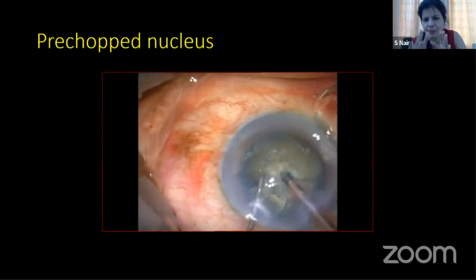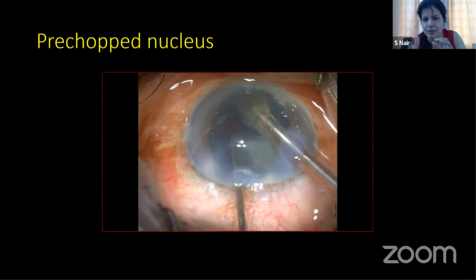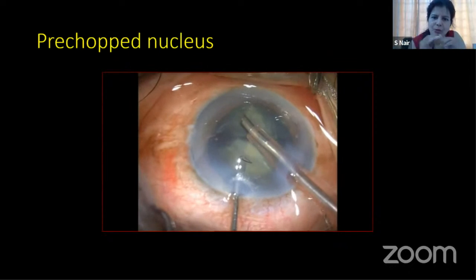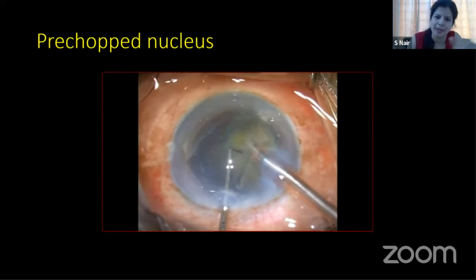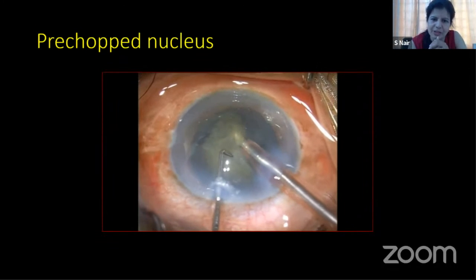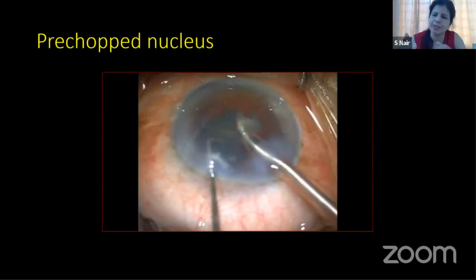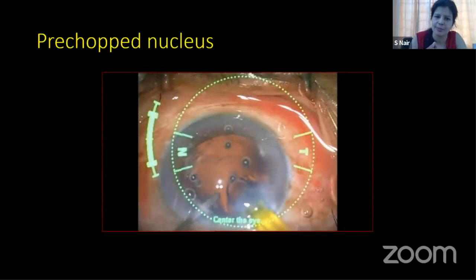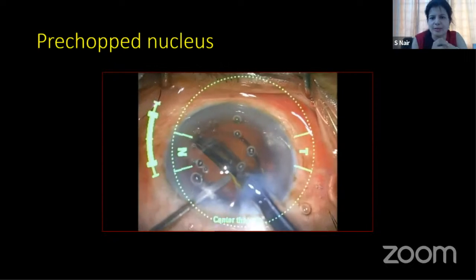So now coming back to the part after phacoemulsification, here the maneuvers are much less because there are nucleotomies made. So you just need to be very sure that you are separating the nucleus completely, because sometimes the nucleotomy doesn't go all the way down in FLACS, and you need to do a manual separation of the posterior plate. And the emulsification carries on. In cortical aspiration, some of the important points that need to be noted, especially after the placement of a CTR, is that the cortex may not come out very easily. You may need to hydro the cortex a bit and then pull it out radially for it to come out easily without disturbing the CTR.